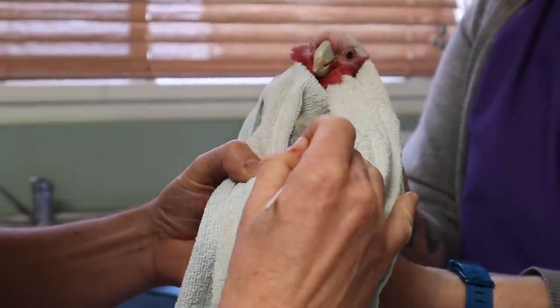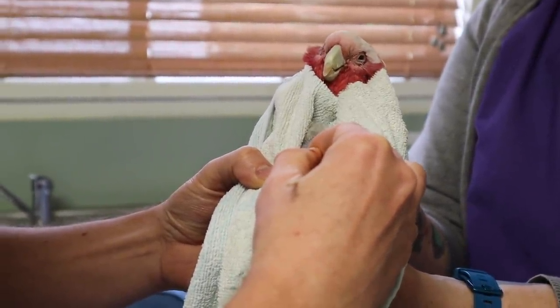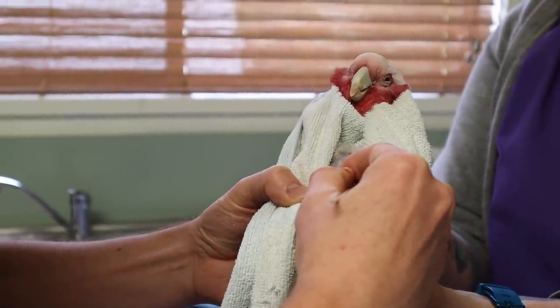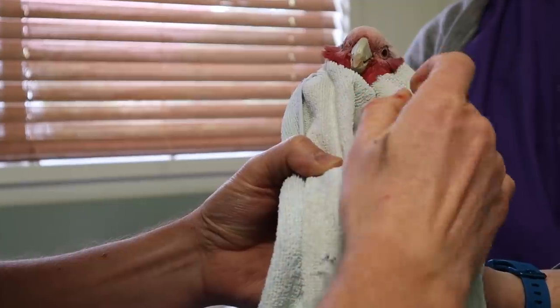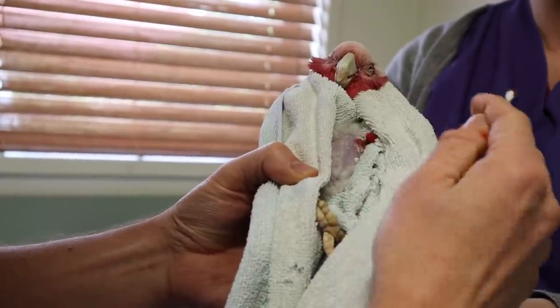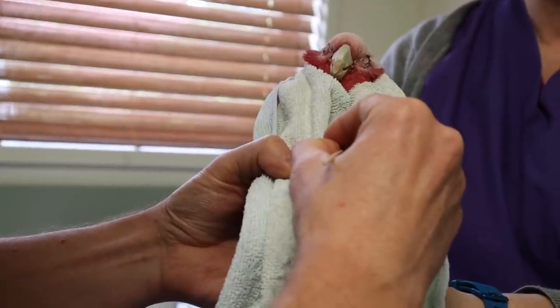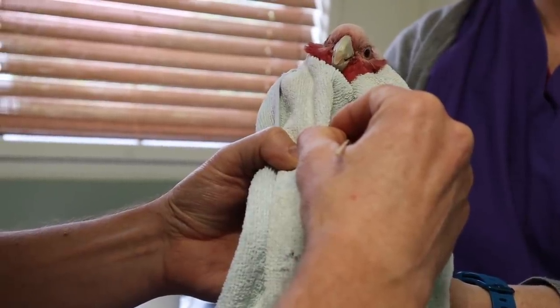There's always a little bit of blood, simply because of the size of the needle. There's more chance of bleeding going down the muscle than up, but just put a little bit of pressure for a time. I find I get much less bleeding if the bird's not flapping — so if they're restrained properly and not flexing those muscles, I get much less bruising and much less complication. You can see the bird wasn't fazed by that at all — still fairly nice and relaxed. It was just a tiny bit of blood spot and that was it. Just gently put the bird back in the cage, and generally they don't have any ongoing issues. Keep them quiet after handling for about 12 to 24 hours — that's the case no matter what, whenever any bird gets injections or anything done at the vet's.